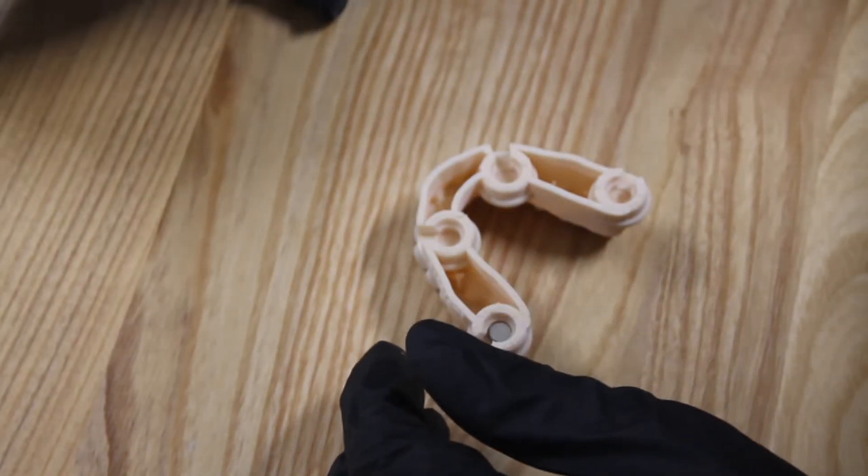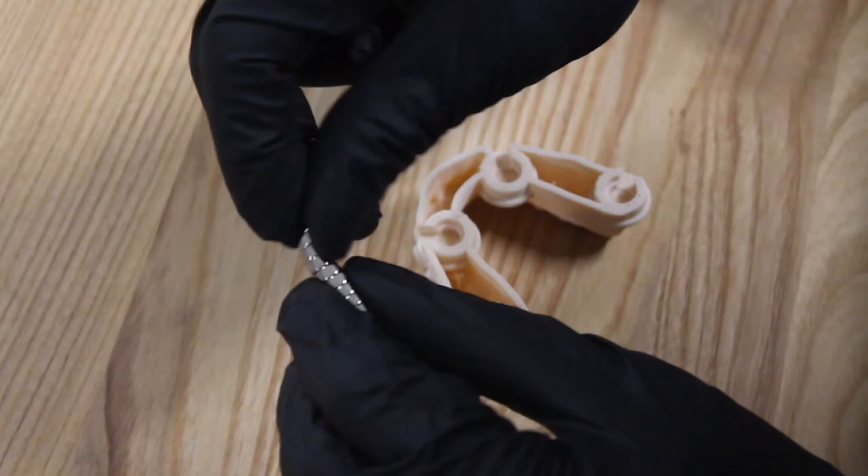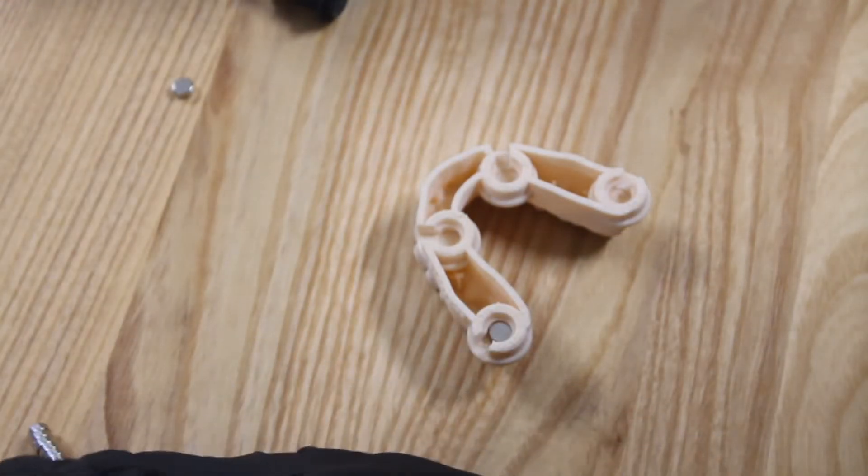The glue jet tool ensures proper placement of the magnets, guiding you to insert them accurately while maintaining the correct pole alignment.